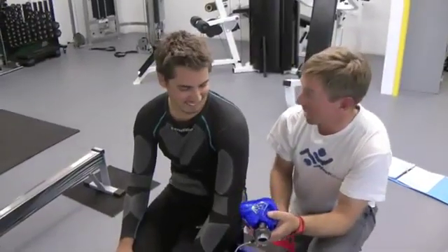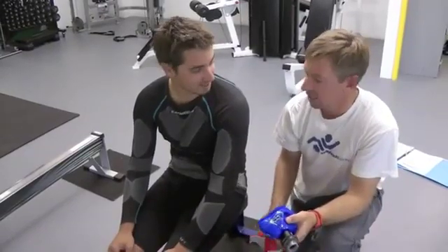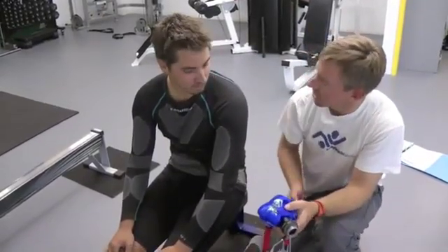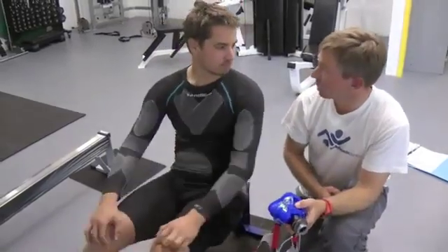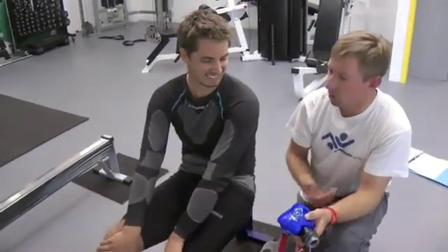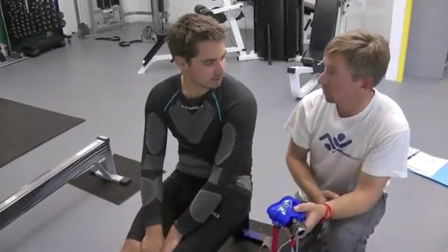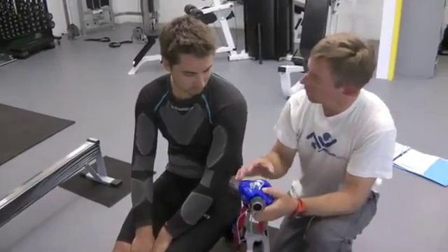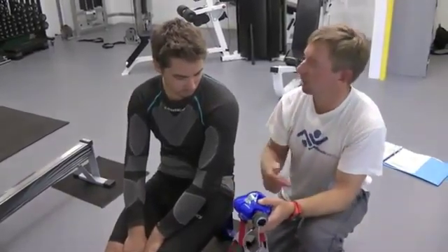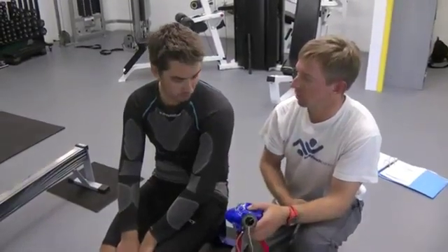So what we're going to do is a VO2 max test. This is a test of the maximum amount of oxygen that your body can use. We're going to use a rowing ergometer, so it's nice and specific to the rowing times that we're doing. It is a maximum test, so it's going to be quite uncomfortable. You're going to row for up to about 10 minutes, and towards the last minute you're going to be absolutely puffed out. We're going to put this mask on you, and then get you to incrementally increase your speed and repetition on the machine until you get to the point where you can't keep going any further.